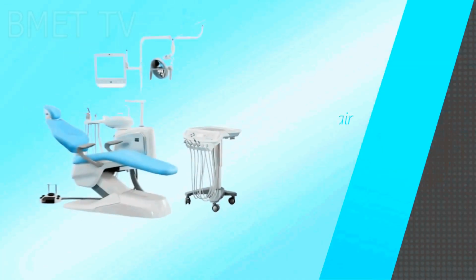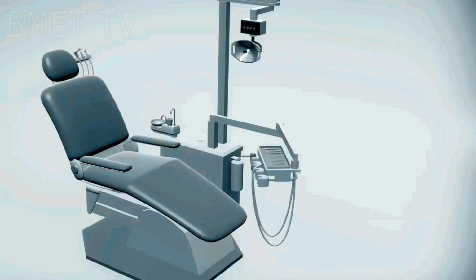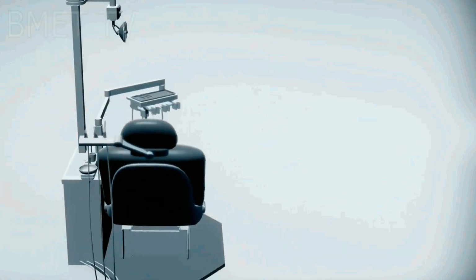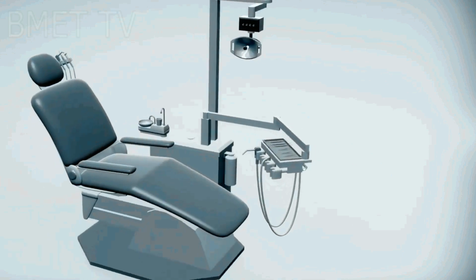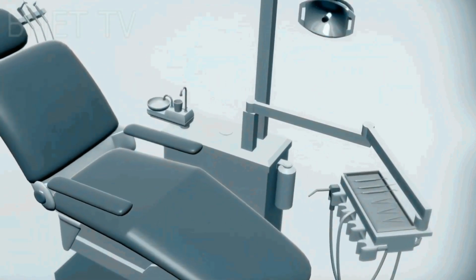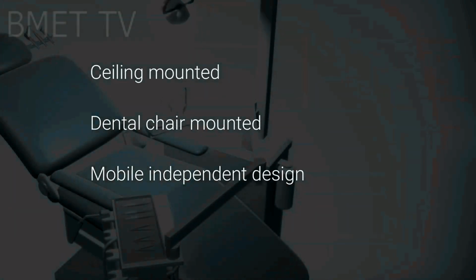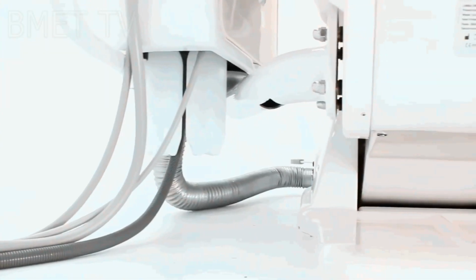Now let's look into types of dental chairs. While Dr. John Naughton's design of the chair became what we more or less use these days, technological advancements have elaborated the same design into 3 new types. While there can be different attachments to the chairs, the design is usually of 3 main types: ceiling-mounted, dental chair-mounted, and mobile independent design. The ceiling-mounted design dental chair is a type of dentist's office furniture that mounts to the ceiling.